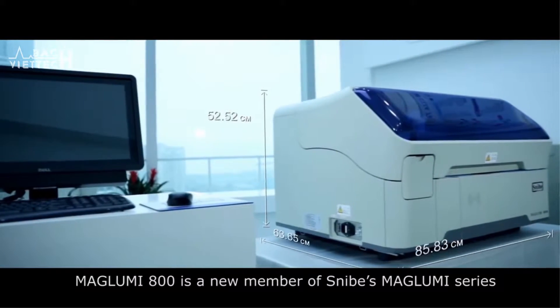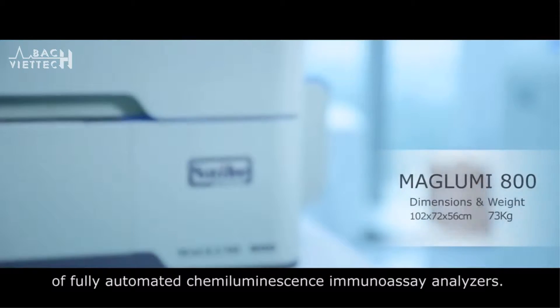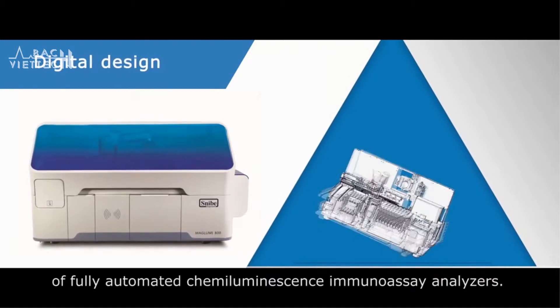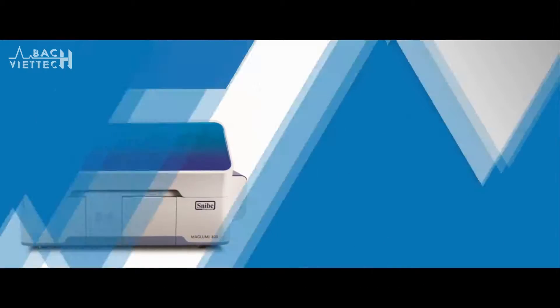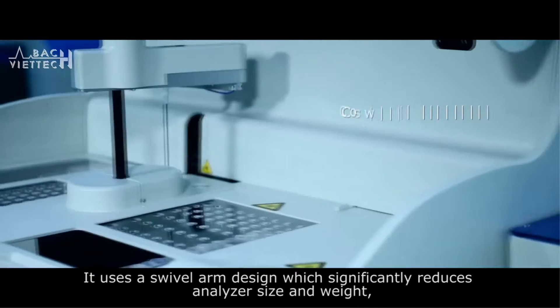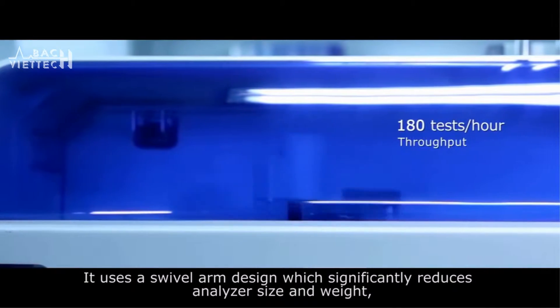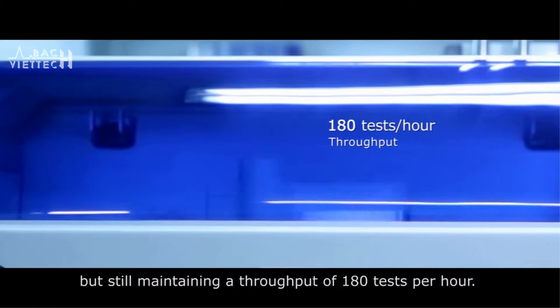MAGLUMI 800 is a new member of Snibe's MAGLUMI series of fully automated chemiluminescence immunoassay analyzers. It uses a swivel arm design which significantly reduces analyzer size and weight, while still maintaining a throughput of 180 tests per hour.